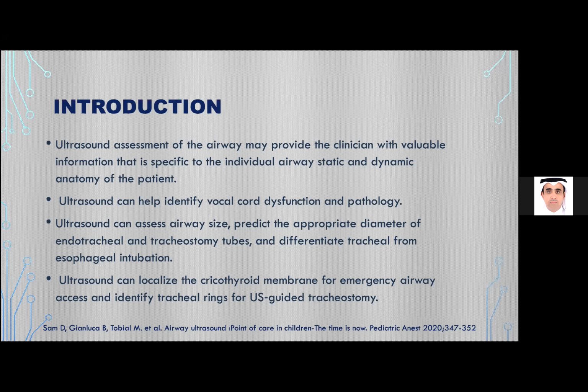When you start to make a good assessment of the airway, it's very important to scan first the mouth, oropharynx and tonsil before intubating the patient. So you have to identify the localization of the oral structures like the tongue and the tonsil and the other structures in the mouth.